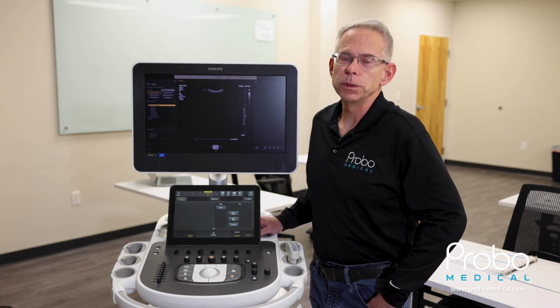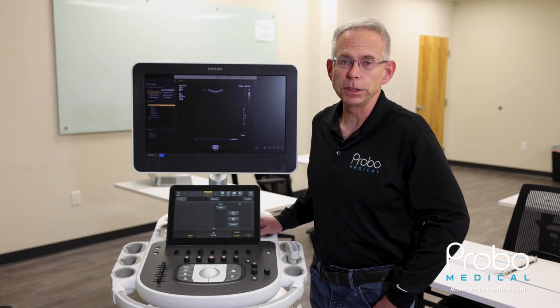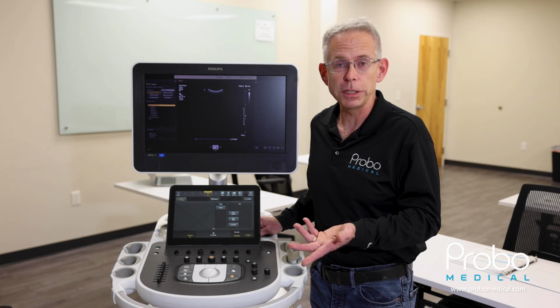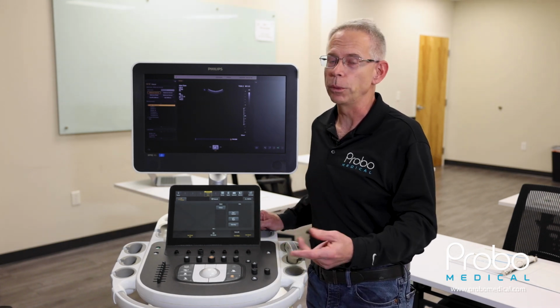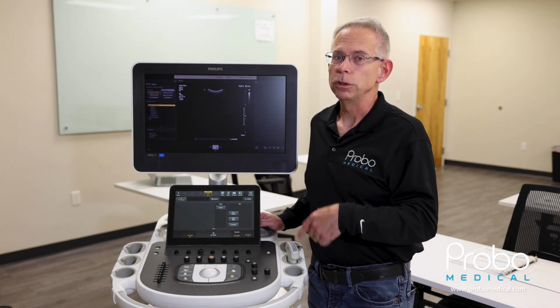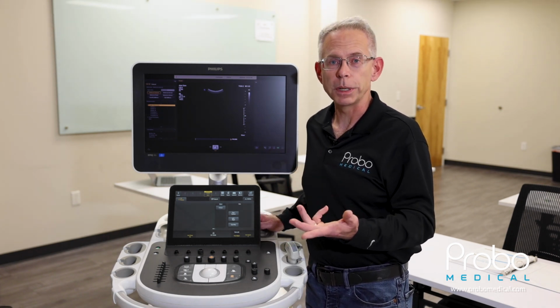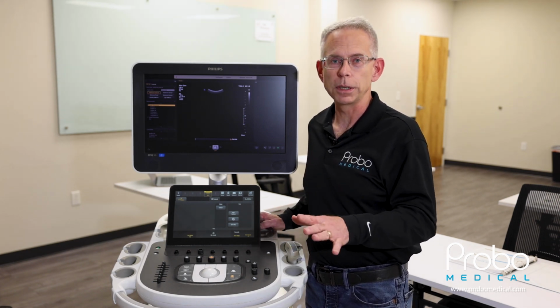So the reason you would do this is if your system might have some lockups or you really just have a hard drive that's full of patients and you need to just get rid of them all at once. So in order to do that, you can go in and run the patient database utility. One word of warning, when you do this, you are getting rid of all of your patient data, not just individual patients. So you wanna be sure that this is okay to do.